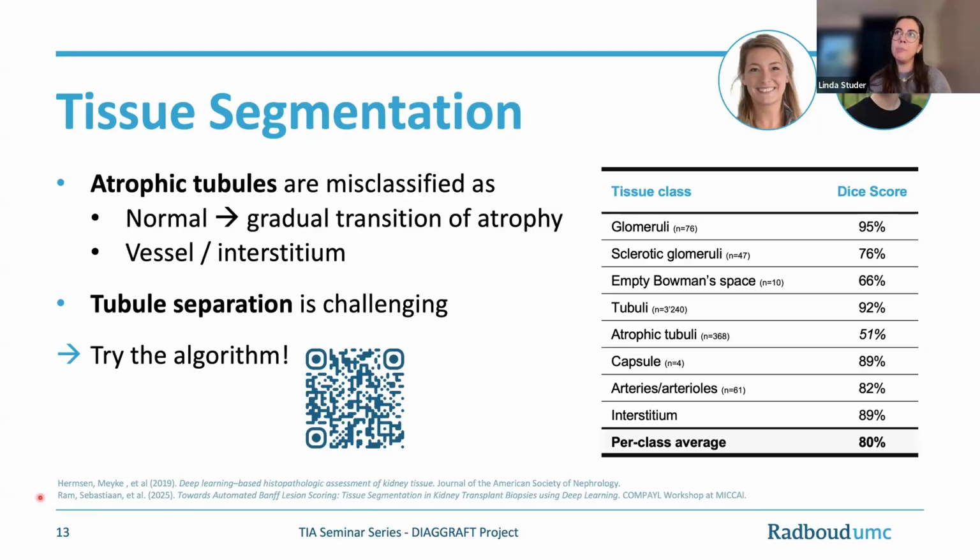But we hypothesized that it is because, I think maybe Virchow, the new version now includes PAS, but as far as I'm aware, none of the other ones actually use PAS-stained data. So that's our hypothesis for why maybe it's not working so well, or we just didn't try the right model for this specific task. But I know there were one or two teams that did use some foundation models in the inflammatory cell detection.